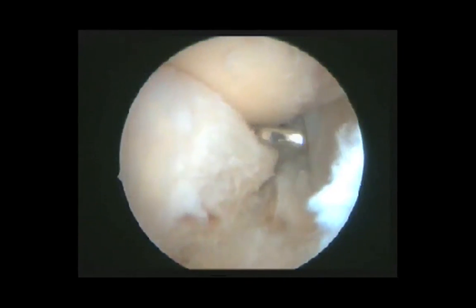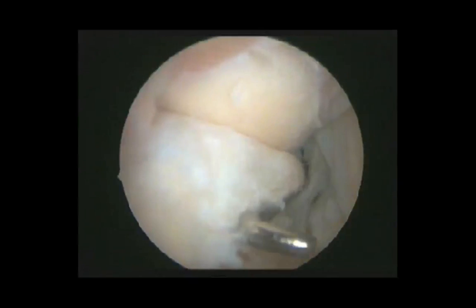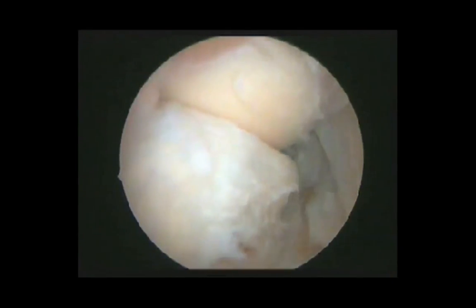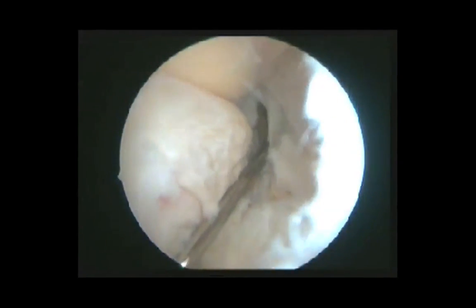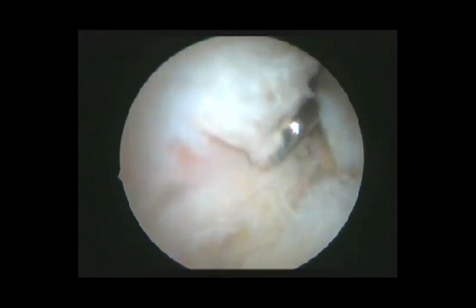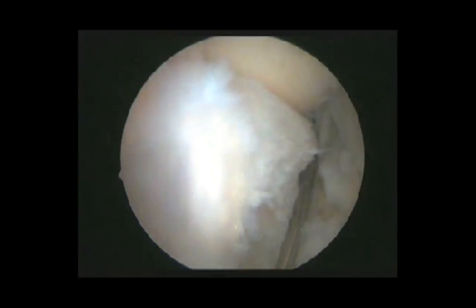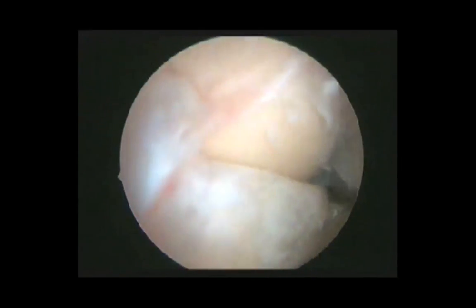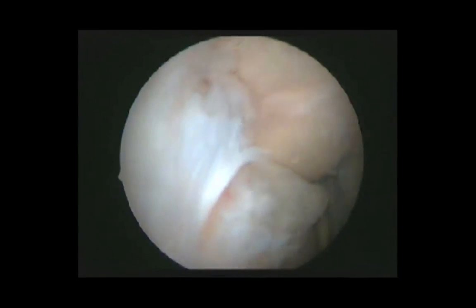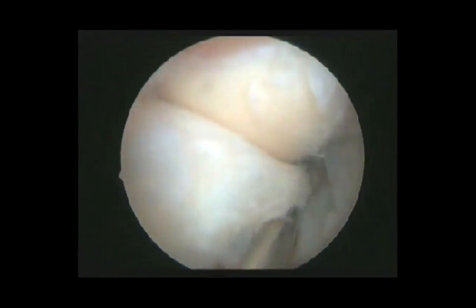We are now examining the posterior compartment from the posterior lateral portal. The medial femoral condyle is clear of all cyst attachments. The posterior tibial plateau is clear of any fibrous tissue, and the menisco-capsular junction is being probed. Here the PCL is visible. We have been slightly gentle on the posterior aspect of the PCL so as not to cause any iatrogenic PCL injury or tear.